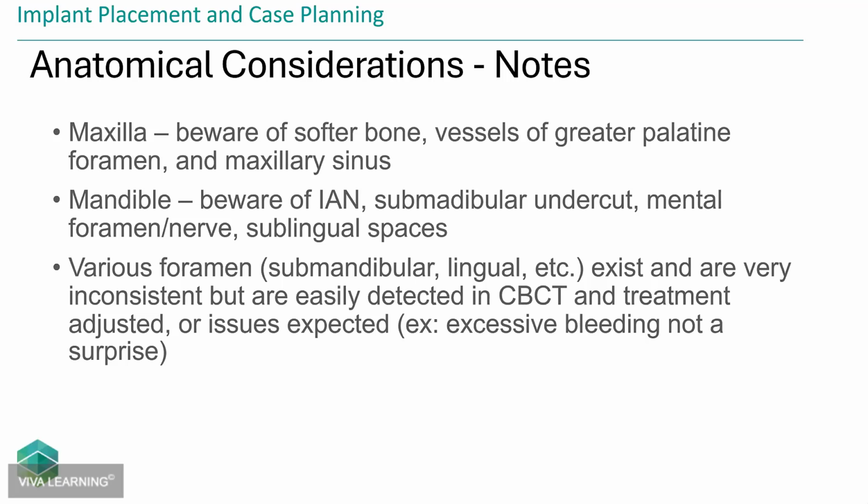And sometimes, this has been the stereotypical nightmare of sending out to oral surgeons, even though I think oral surgeons are awesome, is that they look where the bone is. They put it in the good bone. And then it's up to us to restore the case in that condition. We can look at it as, where do we want the crown to be? Do we have good bone to get a crown in that place?